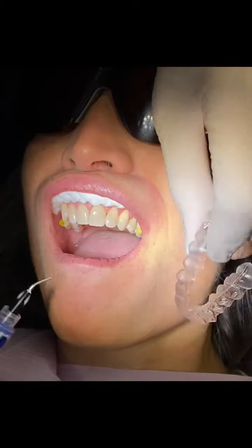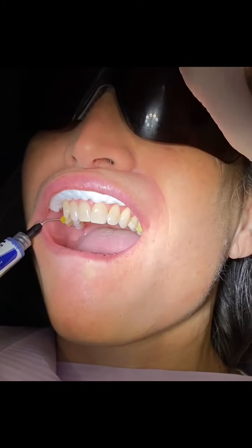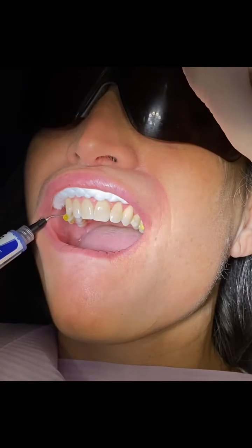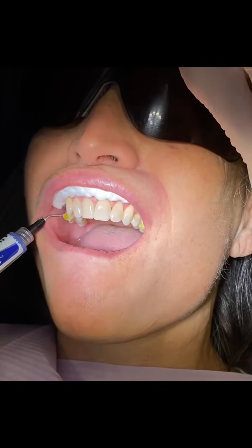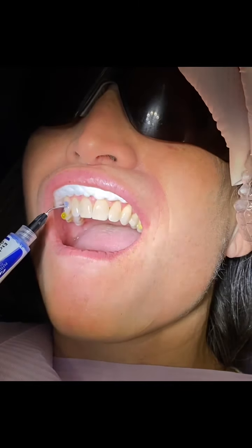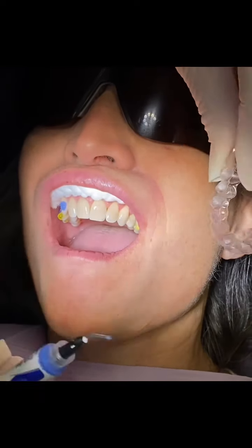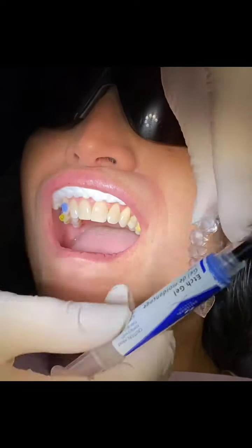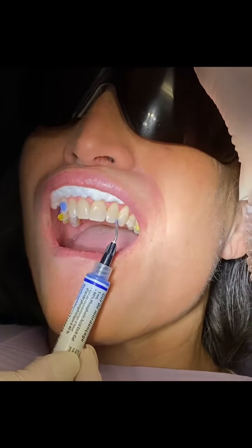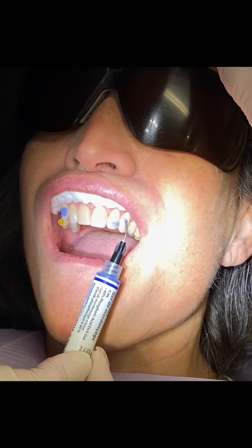We're using a second etch now for the teeth that do not have porcelain. We've already checked which teeth are going to have attachments, and we're placing the etch on those teeth, using the template as a guide to place the etch in the proper position — the exact template showing where the etch and the attachment should be placed.